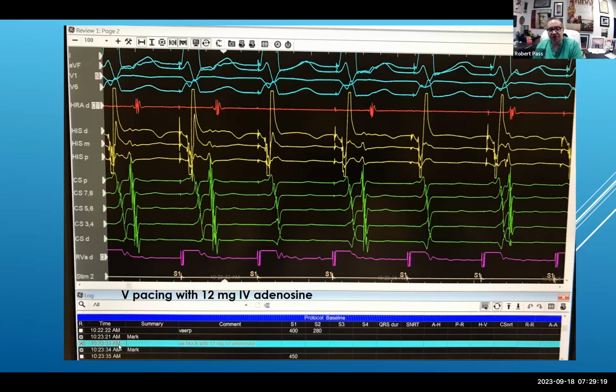But importantly, we want to be sure that we are also not on critical conduction tissue. And so we need to be on the annulus because we believe that pathways are narrowest at the annulus and therefore should require the least amount of radiofrequency energy to ablate them, which is why we always try to ablate on the annulus. You could theoretically ablate in the atrium or the ventricle near the breakout point, but you would probably need a much longer line of ablation and it would be much less likely to be effective.